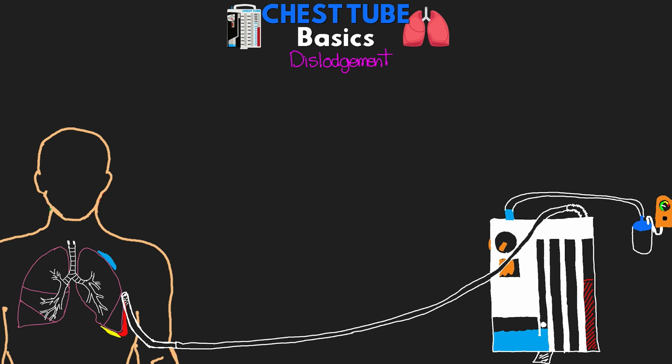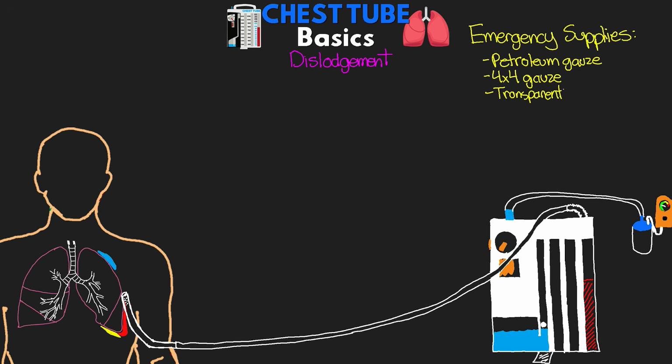So it's really important that if you have anybody that has a chest tube, there are certain things that we're going to want to make sure that we have at the bedside. So you always want to have petroleum gauze, 4x4 gauze, a transparent dressing, as well as a chest tube clamp available. And so the first thing that I want to talk about is if we have a disconnection of the tubing to the chest tube itself.